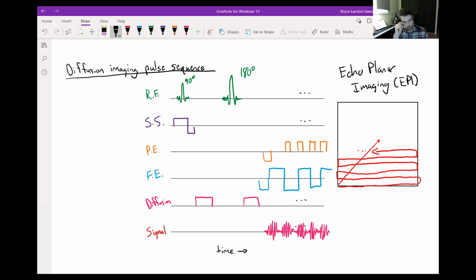And we want to collect our diffusion-weighted slices very quickly, because for one, we are seeing a signal loss because of this whole diffusion thing that we're intentionally bringing out or drawing out of our images. So there's less signal available. And the longer we wait, the more T2 decay decreases our signal, right? It goes quite quickly. So we want to acquire all of our echoes as quickly as possible, but not take so long that our DTI sequence alone is going to take like a half hour or something. We still want to be reasonable, but balance SNR.